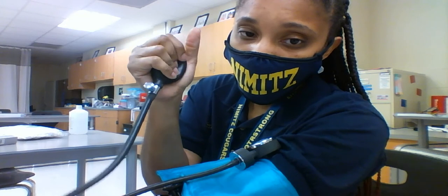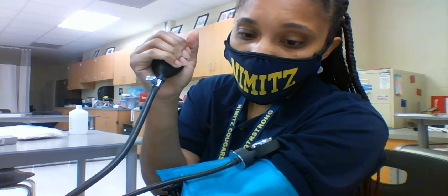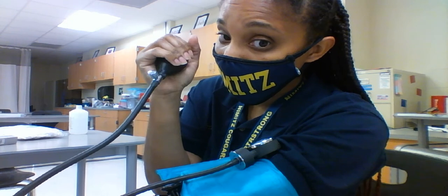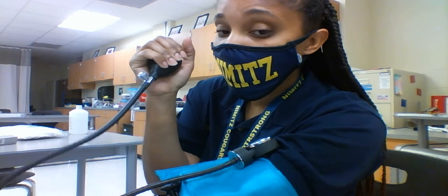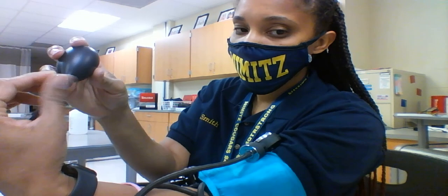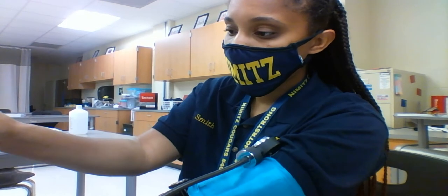When you are pumping and you hear the air coming out, that means that the bladder is not closed. So go ahead and push out all of the air that did escape into the bladder, and make sure that you lock your gauge in order to keep the bladder up.